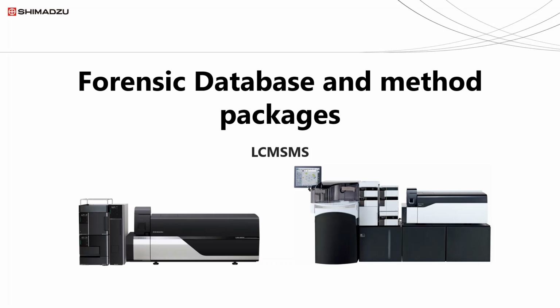Databases or method packages are nothing but a collection of all the method parameters and compound details in a single package, including retention time and other compound details. Basically, method packages make it easy to set up analysis. The chemist does not need to put a lot of effort into method development and method standardization. Sometimes the user does not even need to procure costly standards for routine use. In method packages, there are multiple methods given as per the different categories of compounds and their different chemistries.